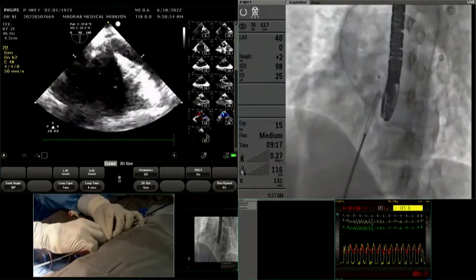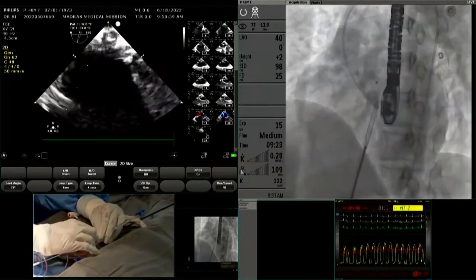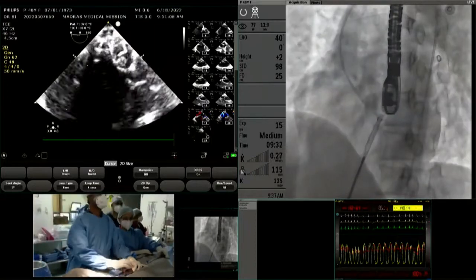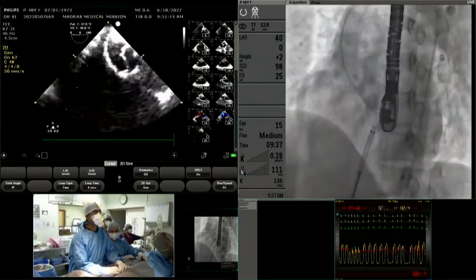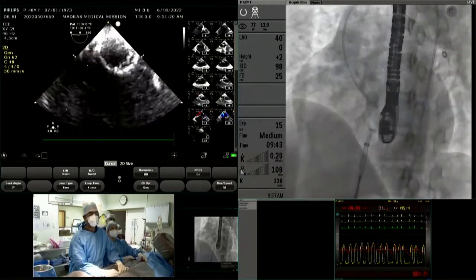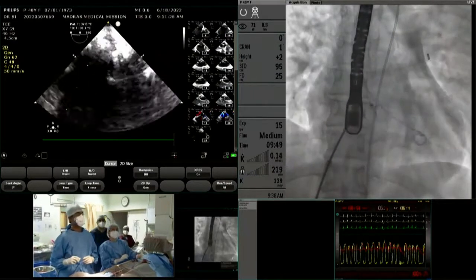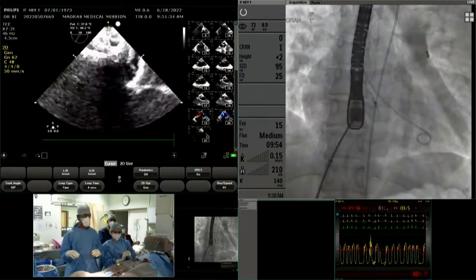Pramod, you are showing me the echo. Yes, sir. Okay. Now I want 60 degree. That's fine. Track my device. No, I want 0 degree. Zero, correct. If you want, you can change the fluoroscopy to AP view. We are okay with that. Okay, please come to AP view. My working plan will always be AP view. No, at that particular time I wanted to demonstrate to you that separation. Now it's fine, you can work in AP, because you can have better orientation now.